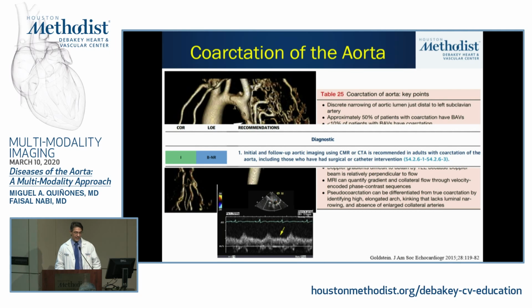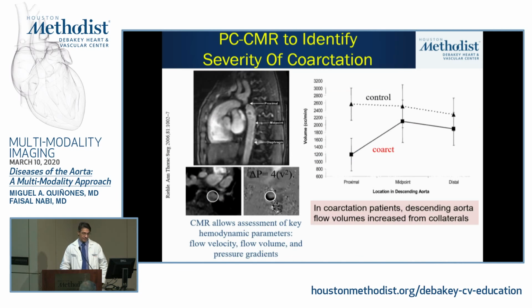As you know, CT and MR are class 1 recommendations by the congenital heart disease guidelines.